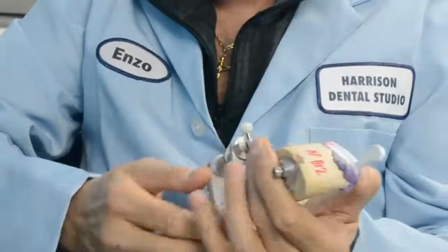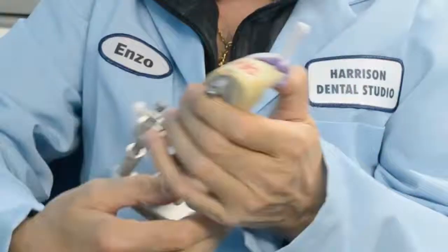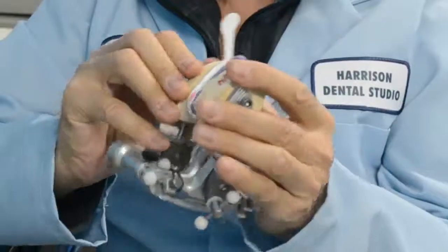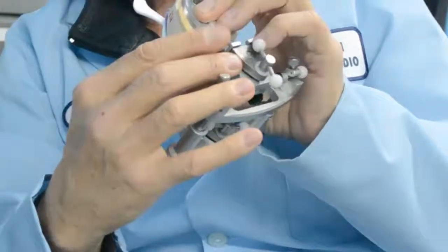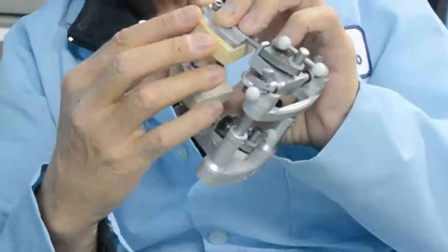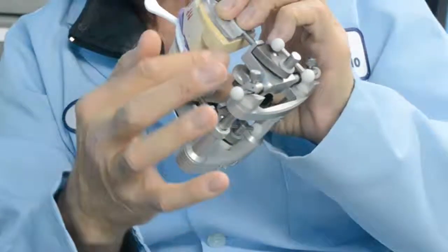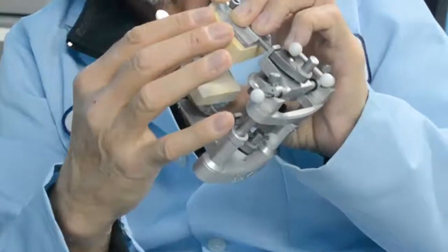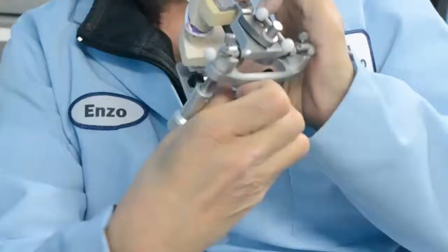If you do have a triple tray, the Enzo Articulator is also unique. What makes this articulator different is that you can put the two parts — top and bottom of the model — together and just hold it in place, where you would normally have to use sticky wax. With our articulator, you're able to hold everything together with your hands. You can use a little pressure, put it in position, and just lock it up. It gives you the opportunity to find your position, simply hold it in place, and lock everything together.